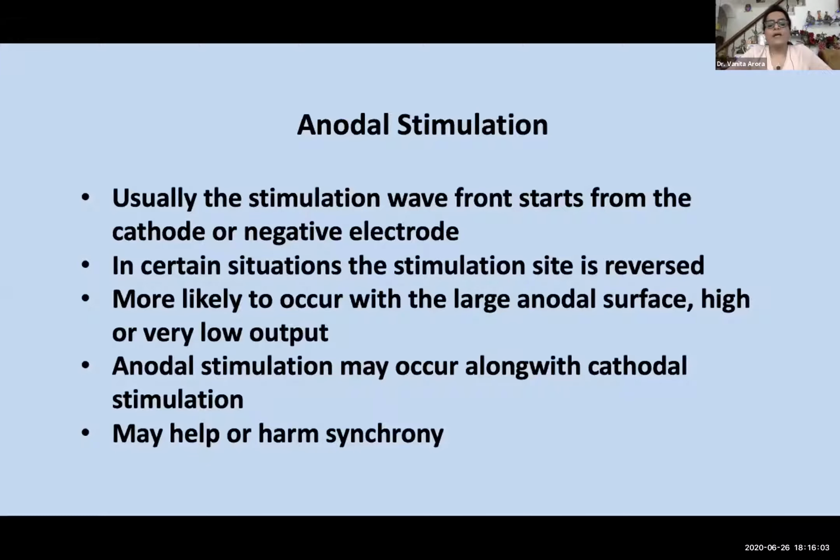And this was true in the older devices. With the third generation of devices that we have as of today, this problem has been taken care of. But in the older devices, we may still see this problem. Hence, I have brought this here to take care of it.